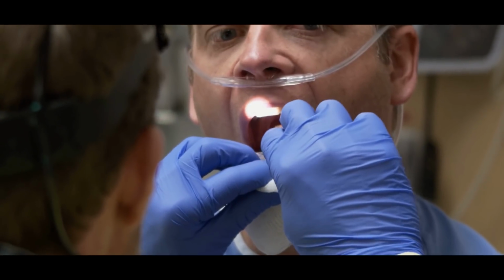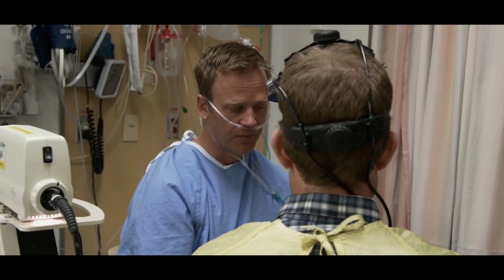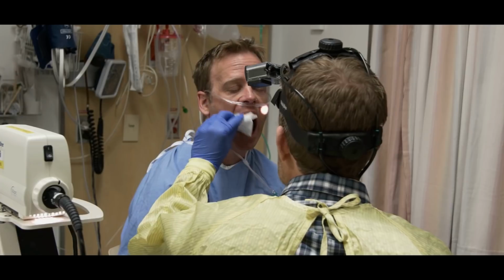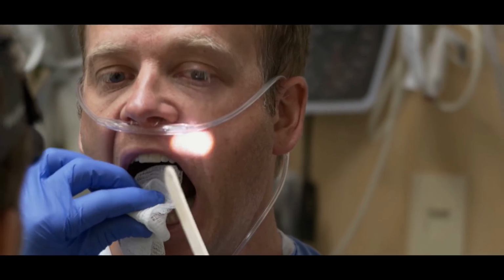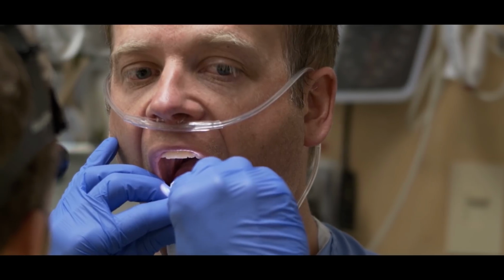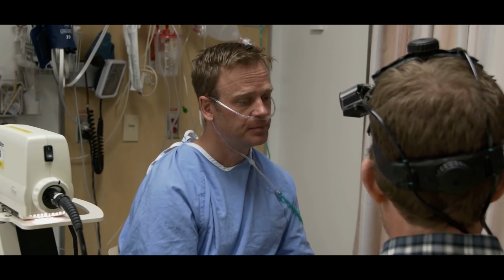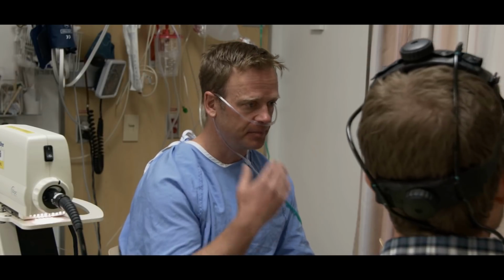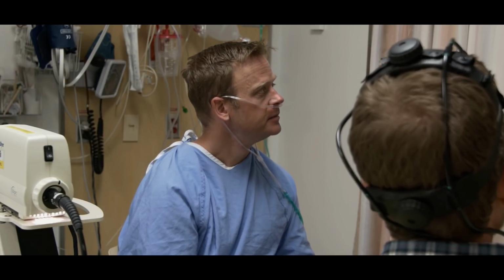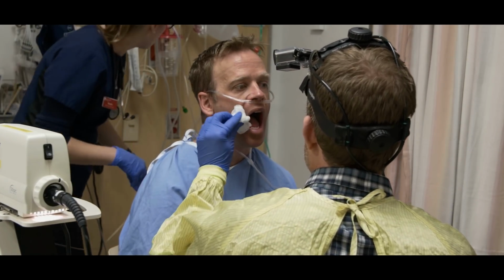Jamie, would you mind opening the, yeah, let's take a breath. Got a little bit left on this. Opening the unused atomizer. The one that we haven't opened yet, the white, the easy spray. Okay, take a break. We have a tiny bit left of lidocaine on this. Feeling some numbness? Okay. And then can we hook that up to some oxygen, please? At 8 liters a minute.